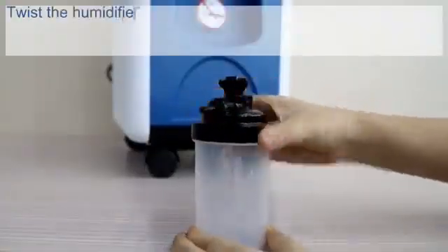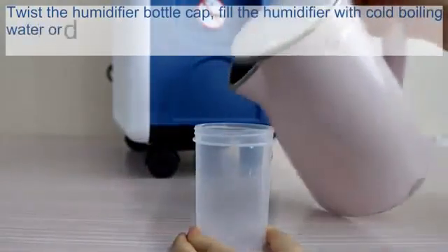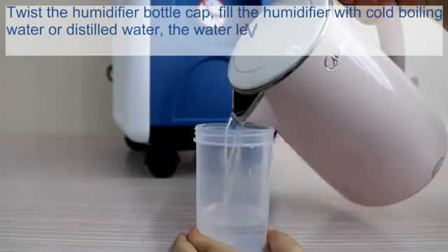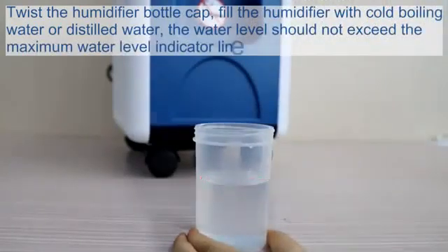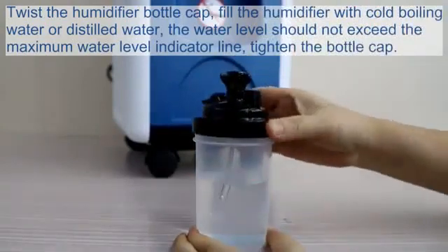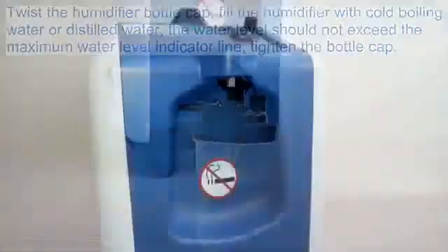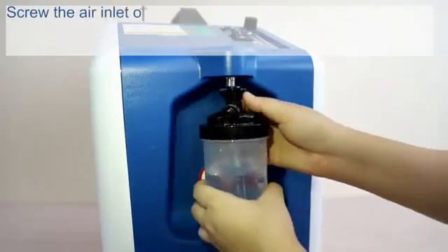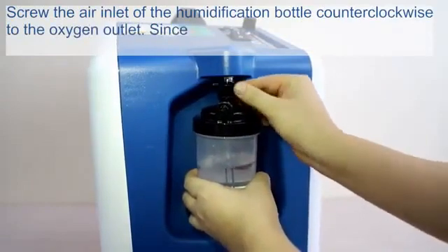Twist open the humidifier bottle cap. Fill the humidifier with cold boiled water or distilled water. The water level should not exceed the maximum water level indicator line. Tighten the bottle cap. Then screw the air inlet of the humidification bottle counterclockwise onto the oxygen outlet.